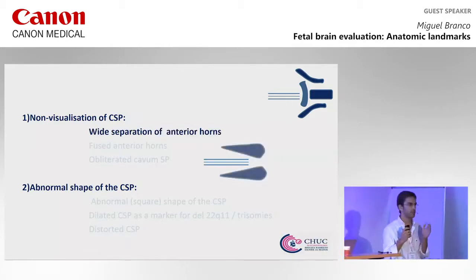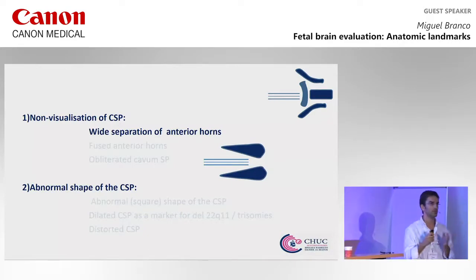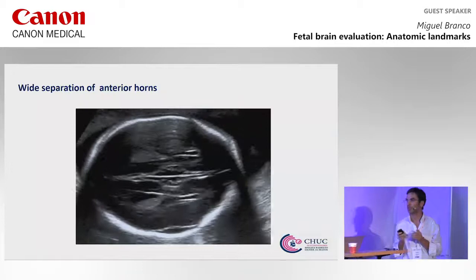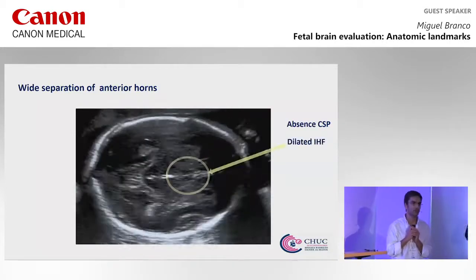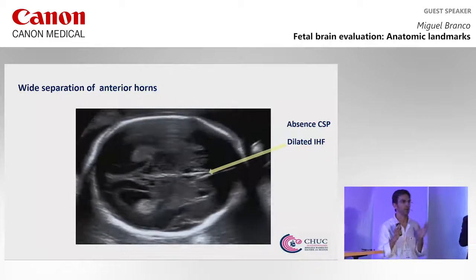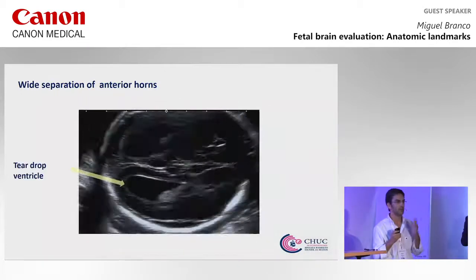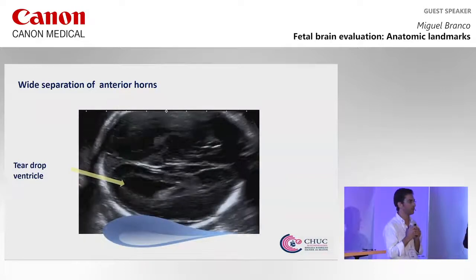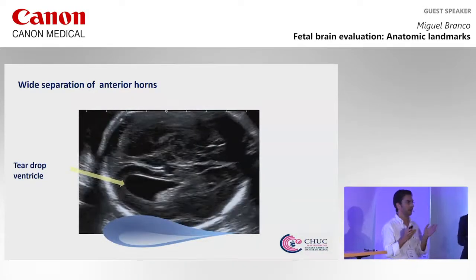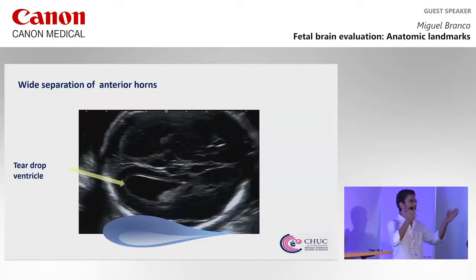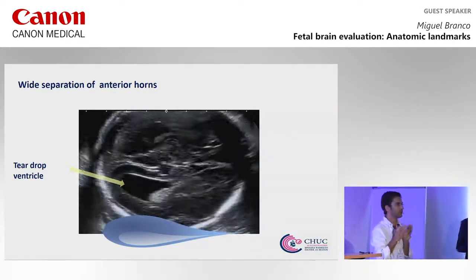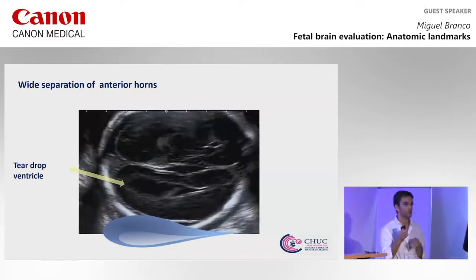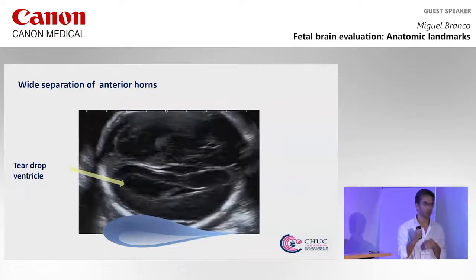For the first group, we start with absent CSP and wide separation of the anterior horns. In this case we are not able to identify the CSP and we have a wide interhemispheric fissure. In association with colpocephalic lateral ventricles and wide separation of the anterior ventricles, this gives the teardrop aspect of the ventricle, which is very suggestive of complete agenesis of the corpus callosum.